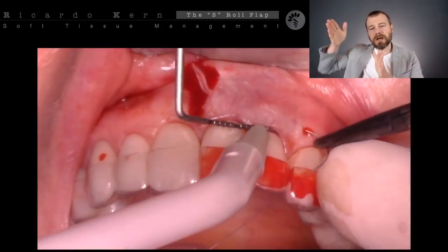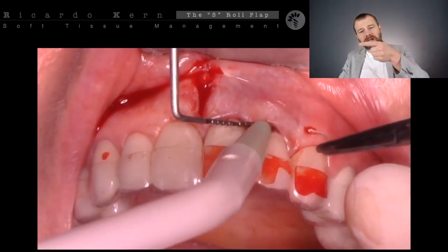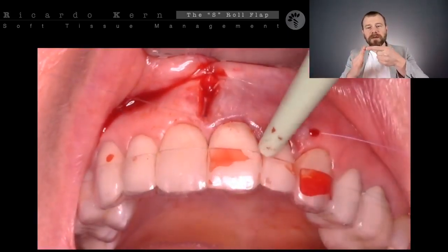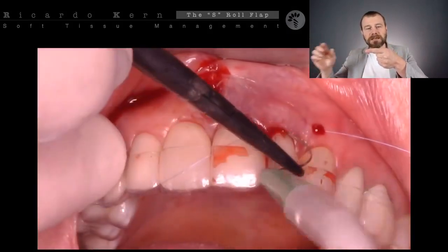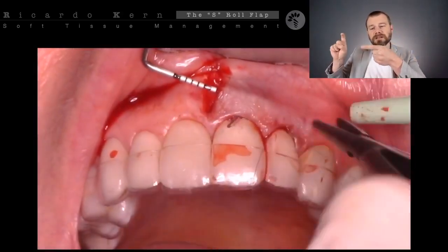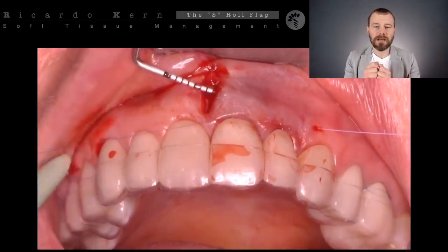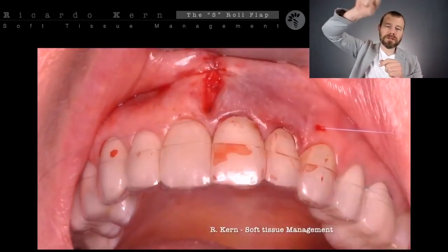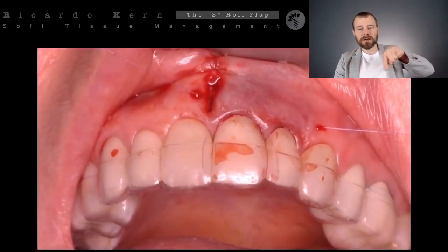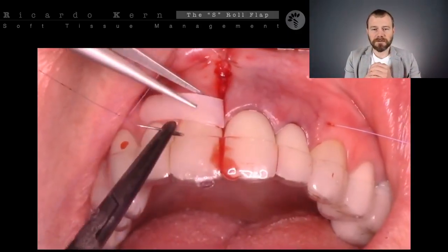Look at that. We are starting the anchorage point from my sutures. You see the probe? The probe is checking exactly at which point I stopped the tunneling. So from that, 1 millimeter distally, it means that the periosteum is stable on the bone. It's exactly this point that I'm going to engage my needle and run through the sulcus. So it's a very stable anchorage point. From one sulcus to another one, from another sulcus to the vista access. You see the needle running backwards, at least with the non-cutting edge in front, okay?